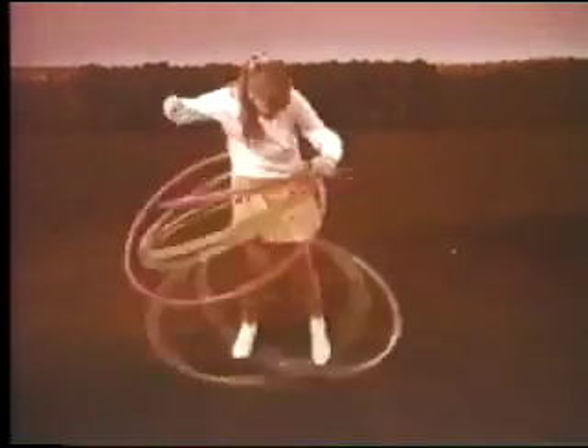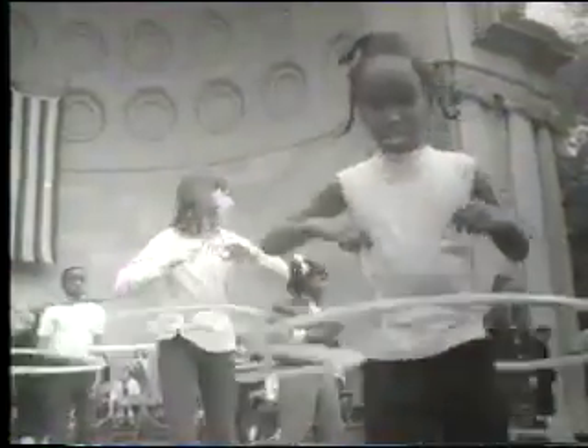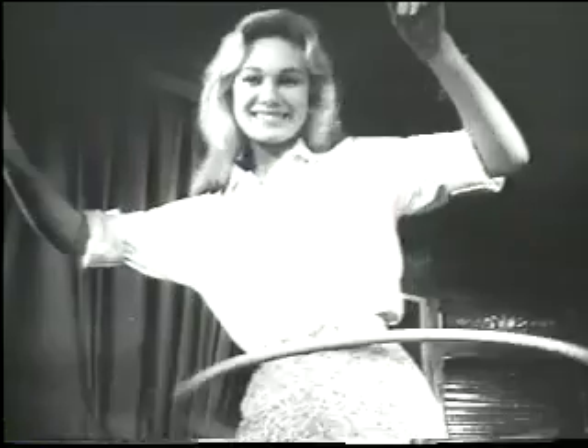Hoops are great fun to play with — not only do children enjoy them, but adults as well. But do they have any use during cataract surgery?